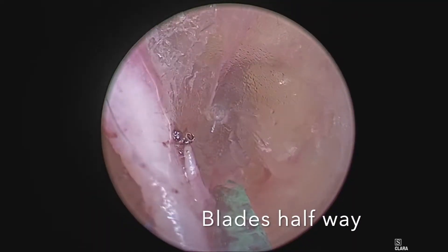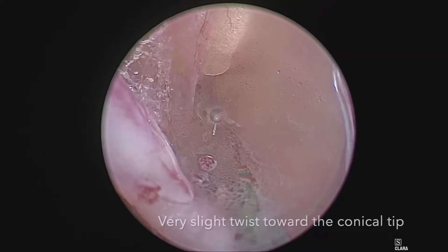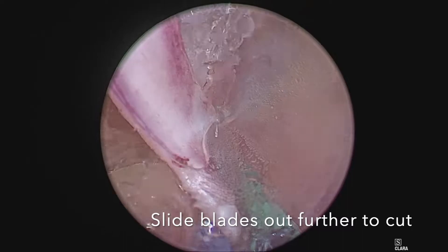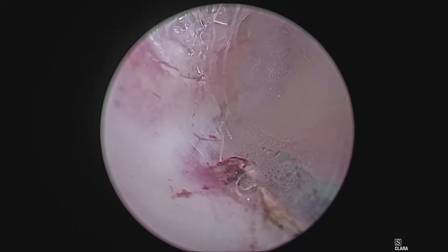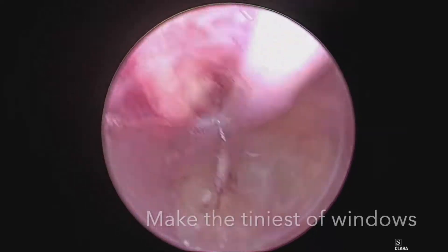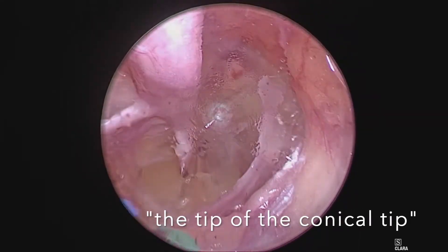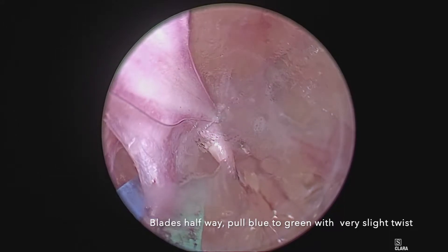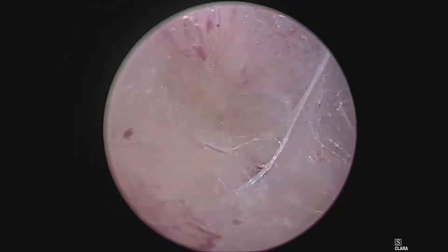I'm using Eric Ping's technique: using the foot pedal, sliding the blades out, engaging the branch, and then with a very slight twist towards the conical tip, I slide the blades out further while cauterizing on exactly the same spot the entire time. The branch will fall away eventually as you move the device forward just a few millimeters. Make the tiniest of windows with this device — there is no need to do more dissection than that. Send your blades out about halfway, pull the blue blade into the green blade towards the conical tip, and while boveying, move the blades forward and the branch will seal and cut.